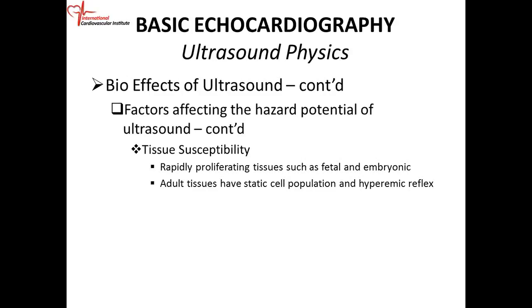And the type of ultrasound that you use, you have to be aware of that. There's more problem with pulsed and continuous wave Doppler ultrasound, as opposed to just your regular two-dimensional ultrasound. So if you're doing fetal work, you have to bear that in mind. You don't want to do a lot of PW and CW. Okay.